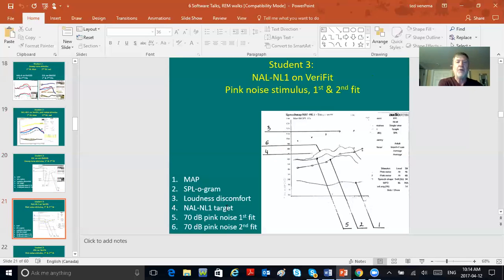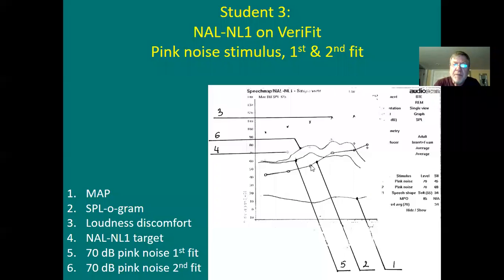So look at number 4. Number 4 would be the targets. Hard for you to see, I know. Maybe I can blink it and bring it closer. Let's try that. So number 4, NAL targets. Here, here, here. See that? Okay, here. You see how you're a third above the thresholds now? So you can tell you're no longer DSL4.